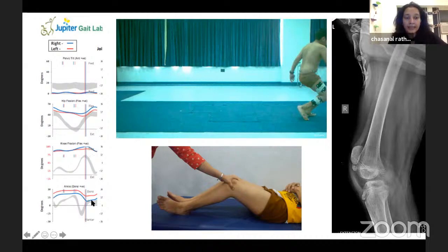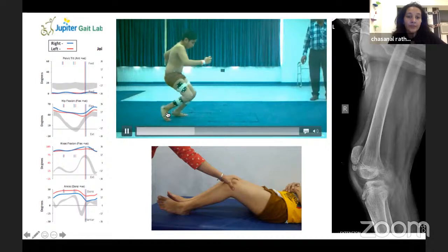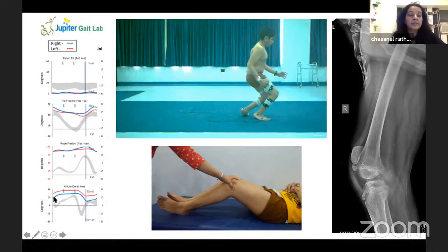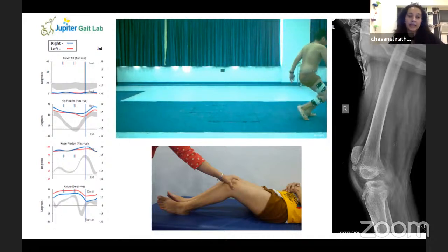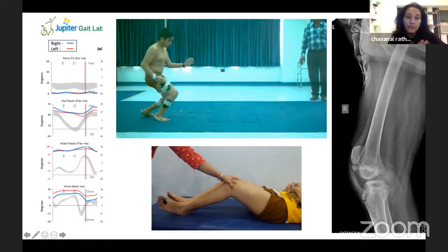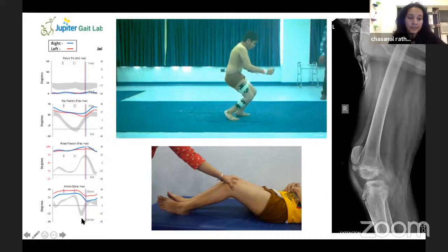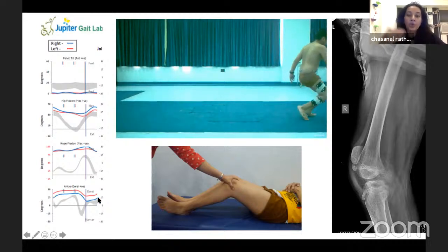And the ankle is actually in dorsiflexion, while it seems like there is an equinus deformity because the heel is up. But when we do the gait analysis, this is what differentiates an apparent equinus in a crouched child from an actual true equinus gait pattern. A true equinus kid will have graphs on the plantar side. Now our graphs have shifted to the dorsal side.